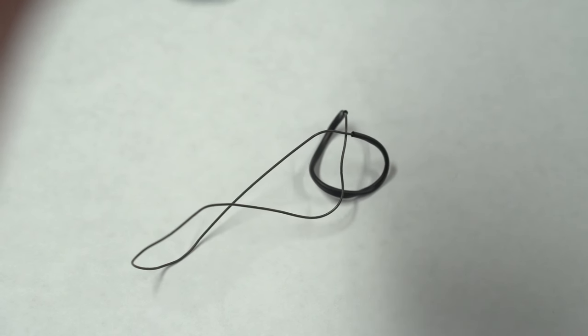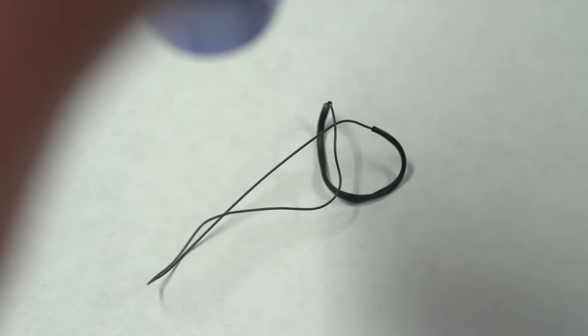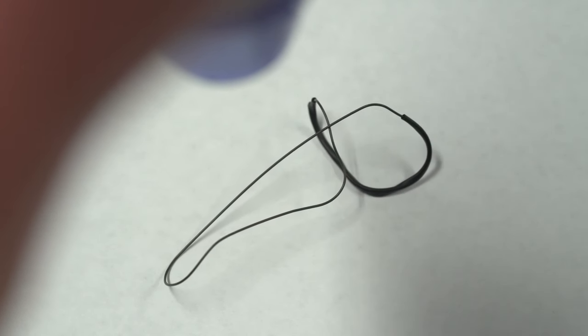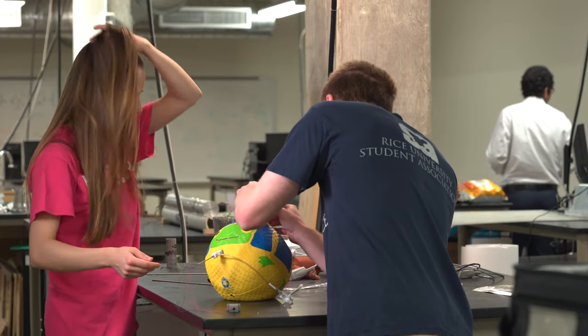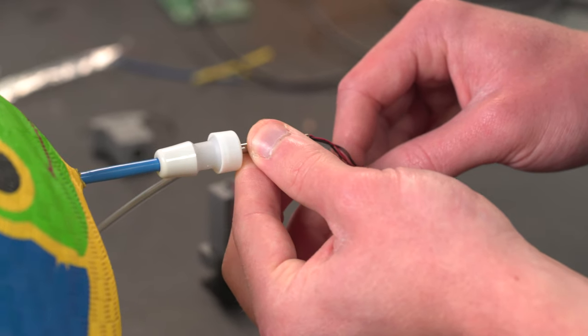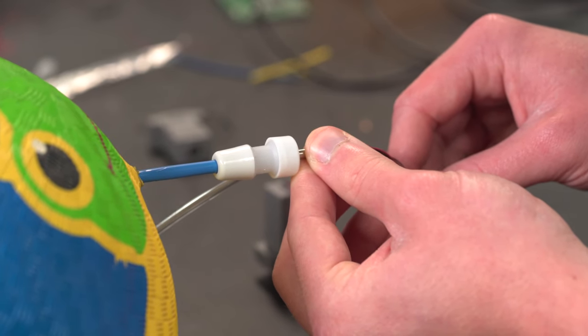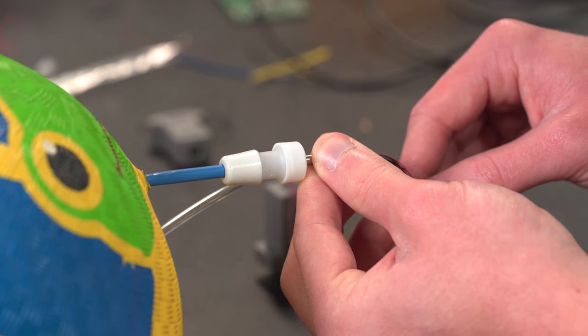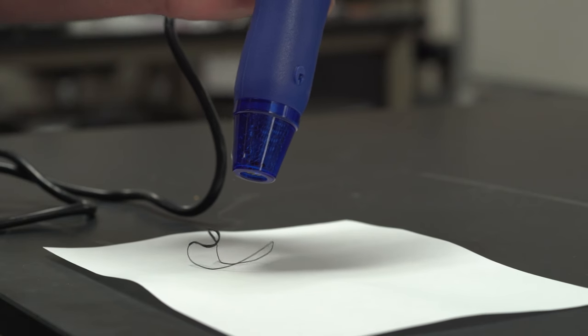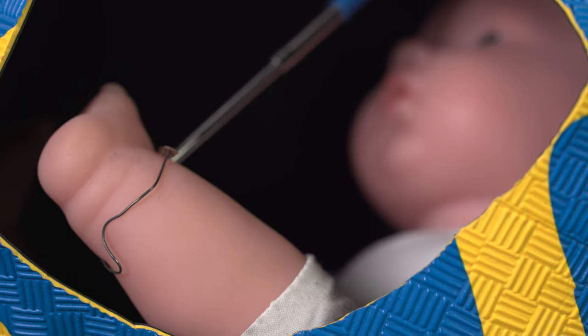Nitinol is a memory shaped metal that you can train to take a specific shape at a certain temperature. It was especially useful when packaging our device flat because we're limited by the size constraint of this trocar, so we had to have a method of flattening our device and then having it expand and be able to be wrapped around the fetus's limb.